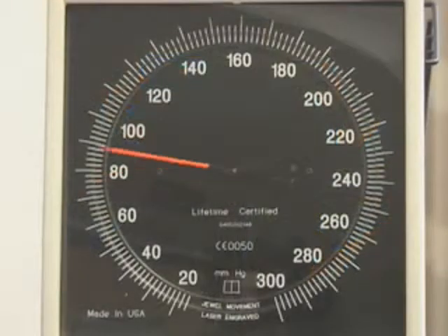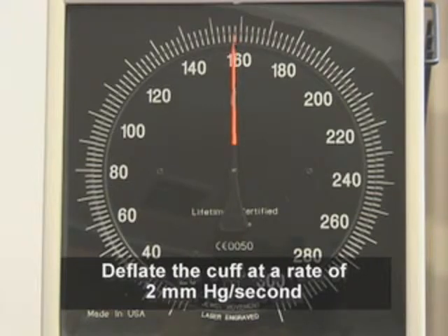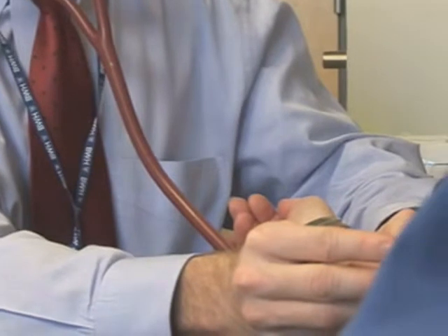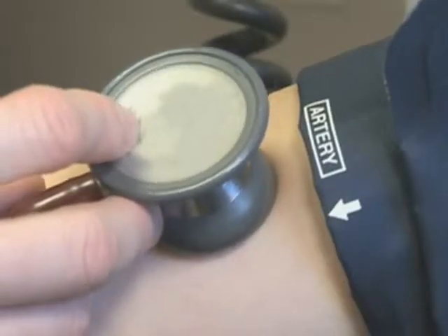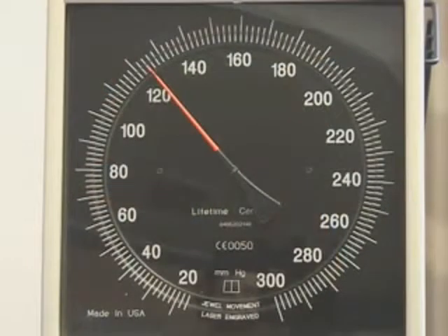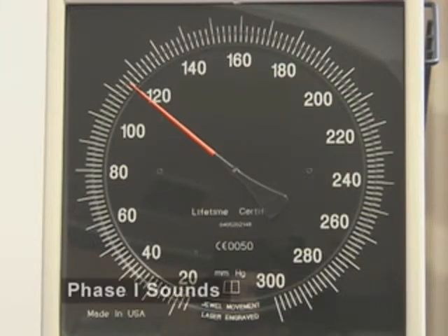Inflate the cuff to a level 20 to 30 millimeters of mercury above the pulse obliteration pressure. Then, deflate the cuff at a rate of approximately 2 millimeters of mercury per second while listening for sounds. As the pressure in the cuff is decreased, blood flow in the brachial artery increases, creating turbulence, which generates Korotkoff sounds. Phase 1 sounds are clear, repetitive tapping sounds that coincide with reappearance of a palpable radial or brachial pulse. The onset of Phase 1 sounds is equivalent to the systolic blood pressure.